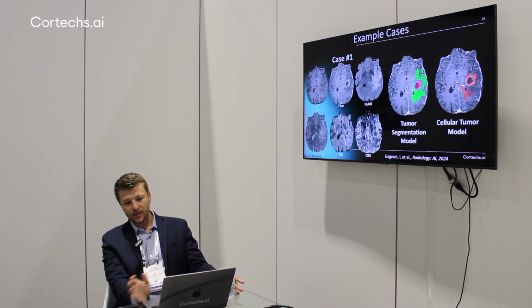So we can see here that what's the cellular tumor is this enhancing cellular tumor. And then if we look back here, we can see that it's also teasing this part out as being cellular tumor. And it's actually not surprising if you go back to the original images, you can see here that you have this intermediate T2 hyperintensity. Typically edema is very bright on FLAIR, bright on T2. But you get this intermediate signal and a little mass-like signal here, where this, in fact, is infiltrating tumor across the corpus callosum. And so you can separate, based on these initial segmentation maps, what's the enhancing cellular tumor and what's the non-enhancing cellular tumor. And same thing if you go back to the RSI map and the CBV map, you can see the RSI map is really bright where this infiltrating tumor is extending across the corpus callosum, and the CBV map is also bright. There's a lot of blood flow going there.